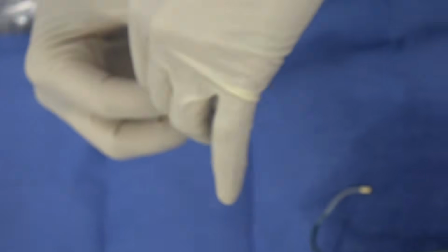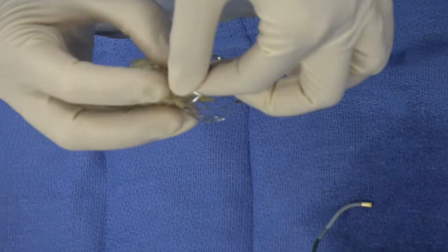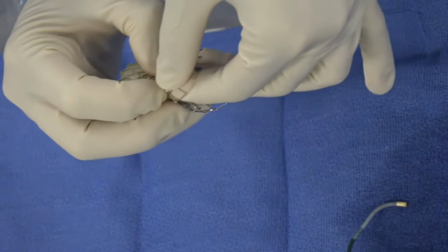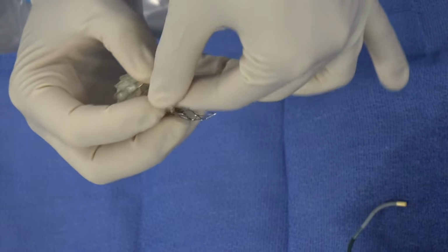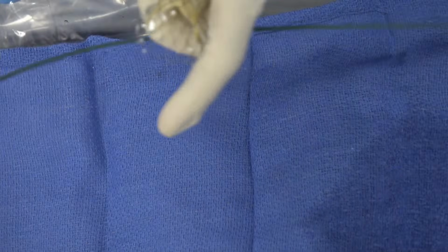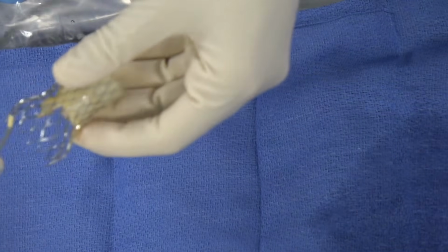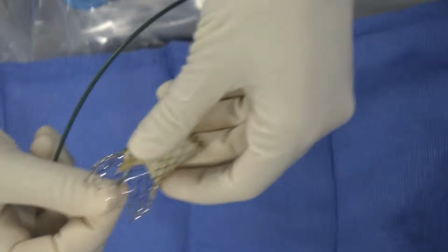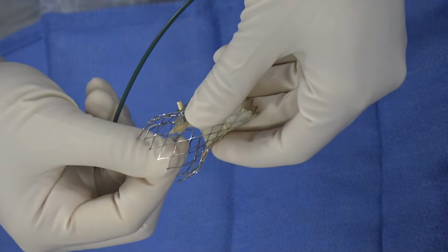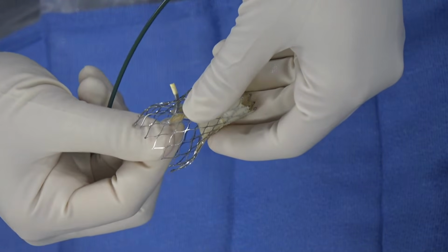Just look at it. I'm trying to compress it. Look at that. It's not getting compressed. This is because metal is strong. I'm putting pressure. Look at it. So that thought process should never exist. And the goal is that when the guide is going through the diamond, you're able to see this. There's enough space. Yes, even a 6 French guide goes through very nicely.